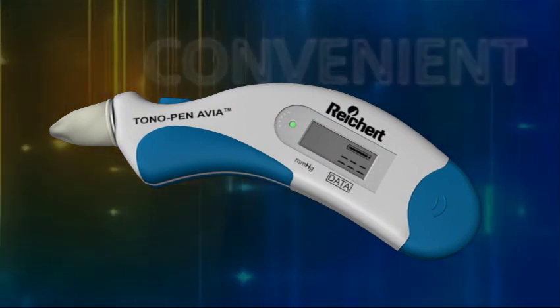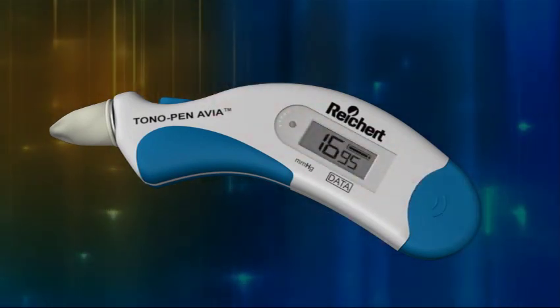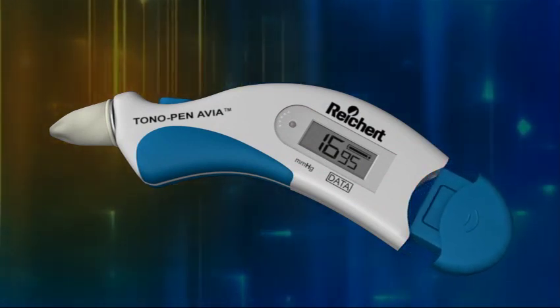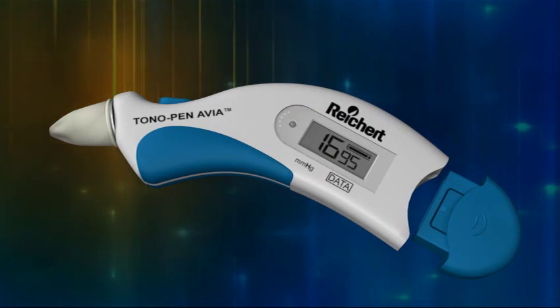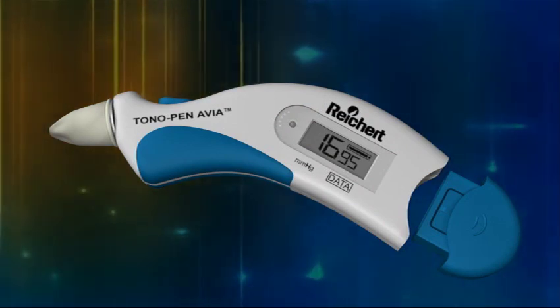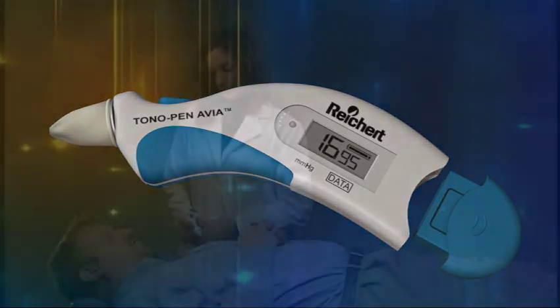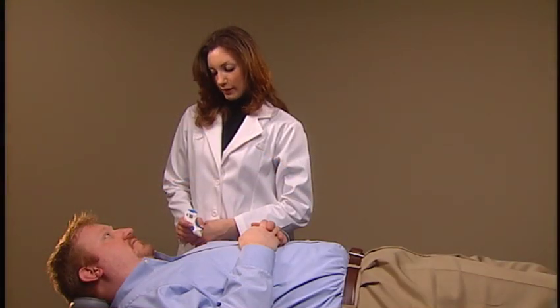The instrument is lightweight, convenient, and accurate. Its handheld design, compact size, and self-contained power source make it easy to use and a valuable tool for performing intraocular pressure screenings in the office as well as out of the office. And it's patient friendly too.